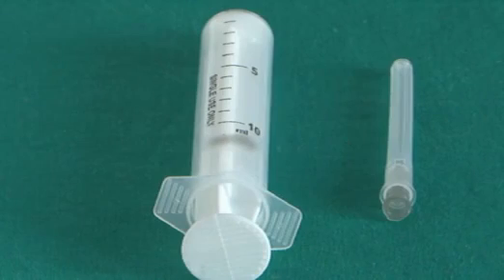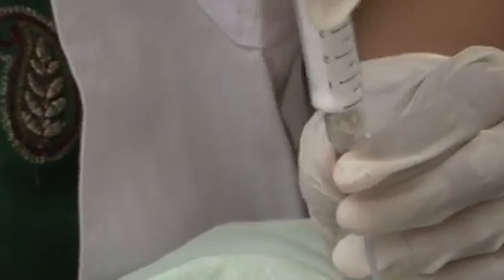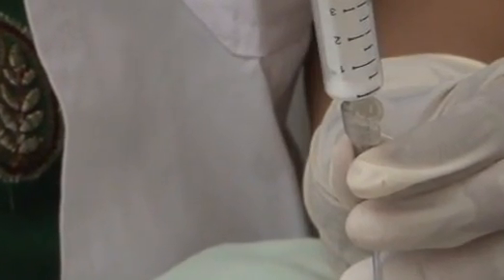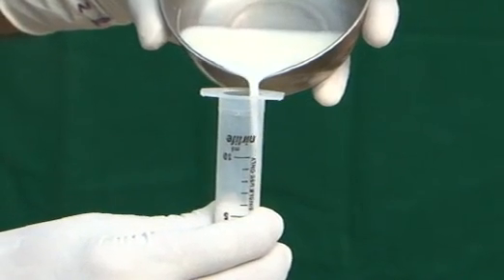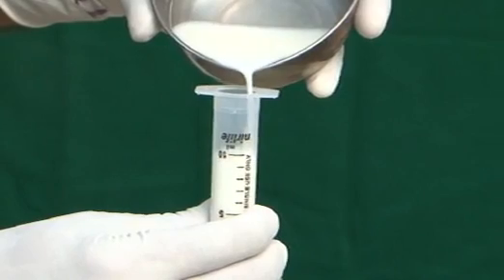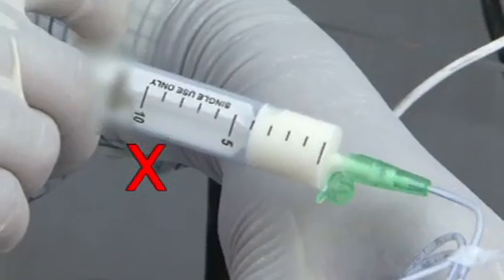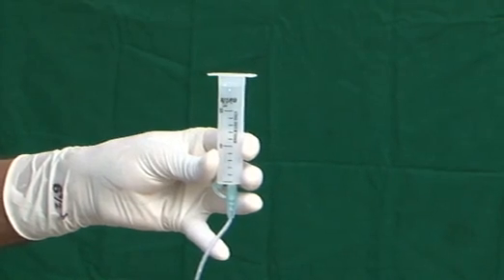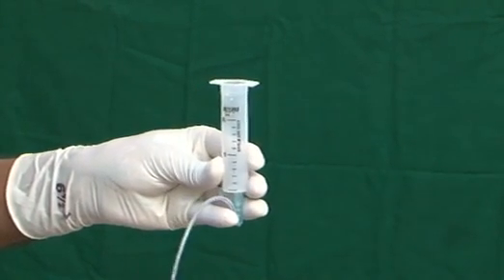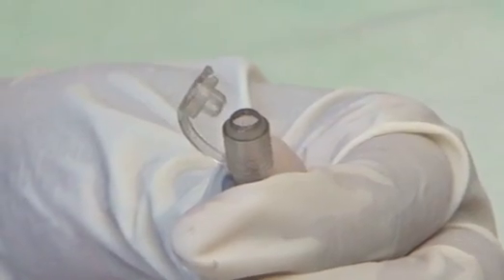Use an appropriate size of syringe for feeding, 10 ml or above. After opening the cap, attach the syringe barrel to the hub of the tube. Keep the syringe vertical and pour the required amount of milk into the syringe. Let the feed go down slowly under gravity and do not push with the plunger. Once the syringe is empty, pinch the tube to prevent entry of air. Remove the syringe and close the hub of the tube.